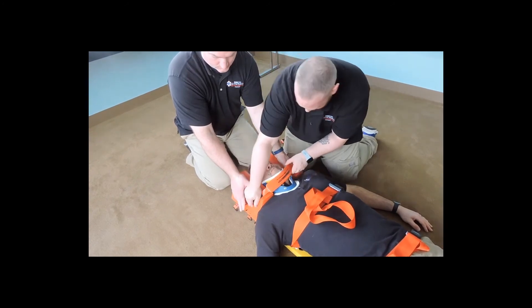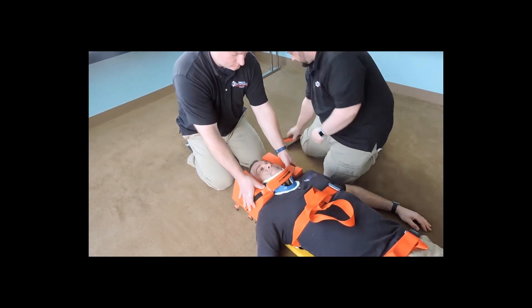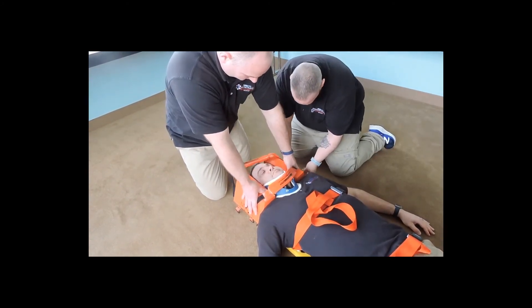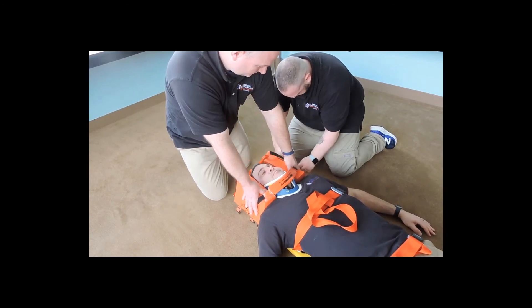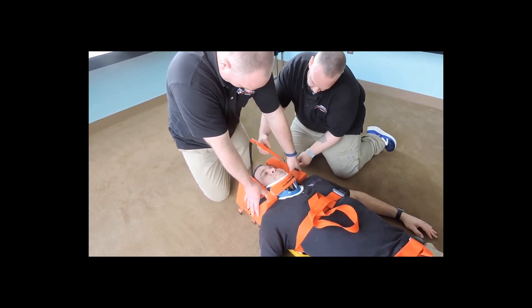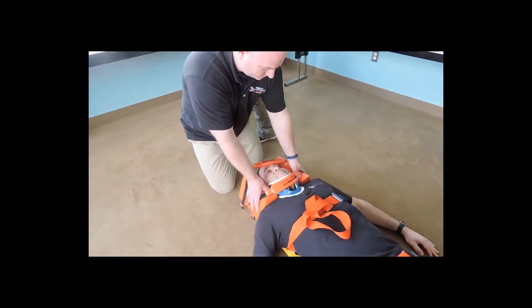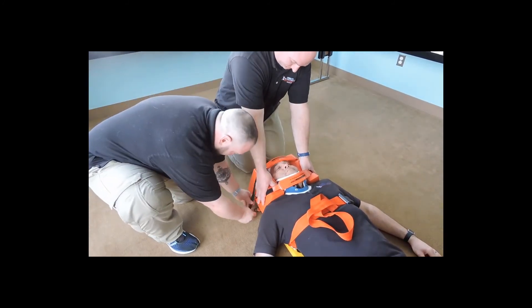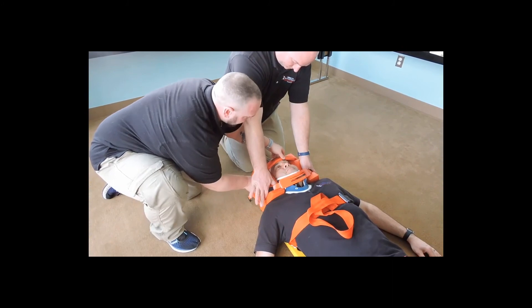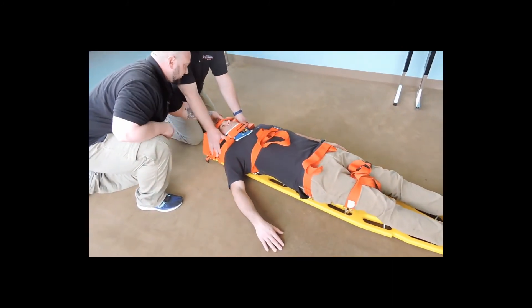We want this to secure. You doing okay, sir? All right, I just want to go over the forehead. Again, working with my patient and my partner — coming around, across the strap. If we have this secure and in place.